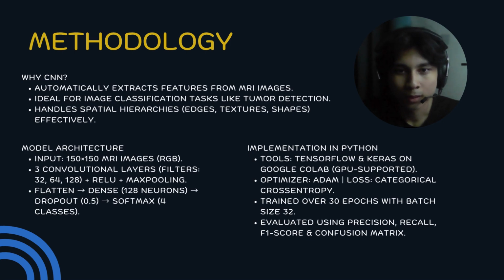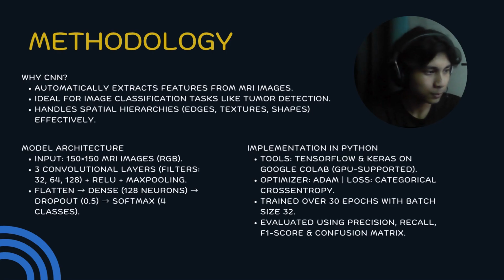Implementation details. We built it using Python with TensorFlow and Keras, running on Google Colab with a GPU. The model was trained for 30 epochs using the Adam optimizer and categorical cross-entropy loss. Performance was evaluated using classification metrics and visualized via a confusion matrix.